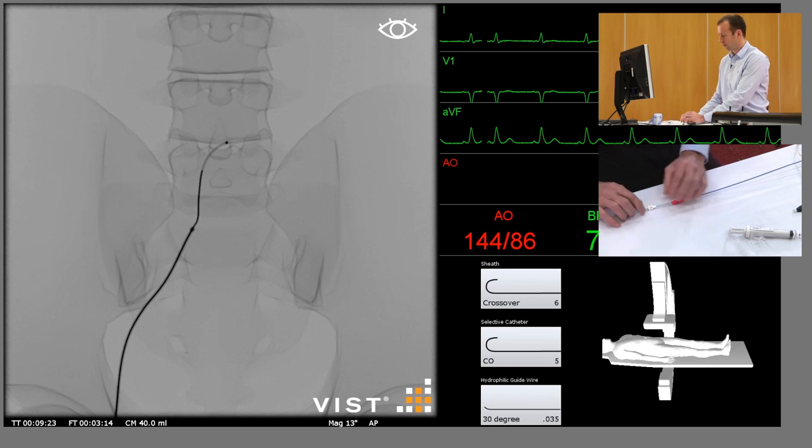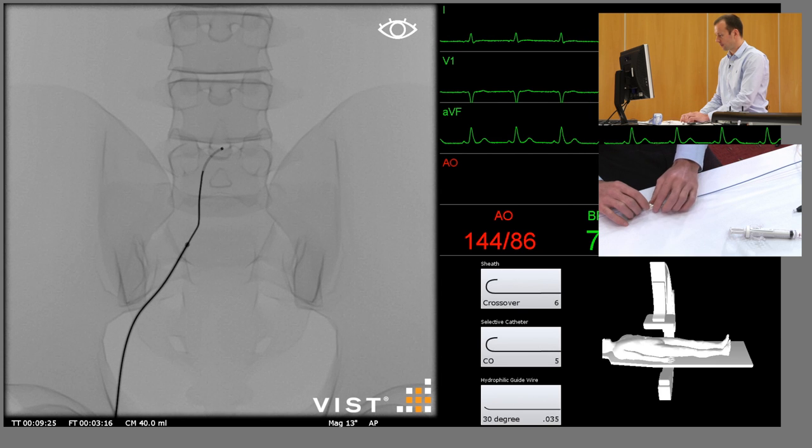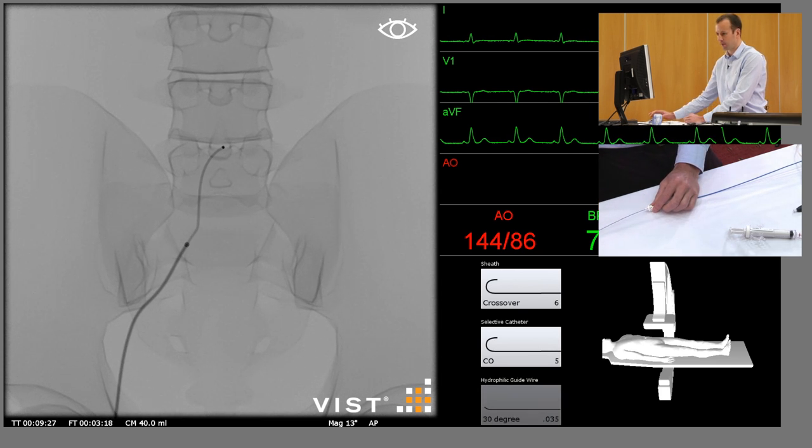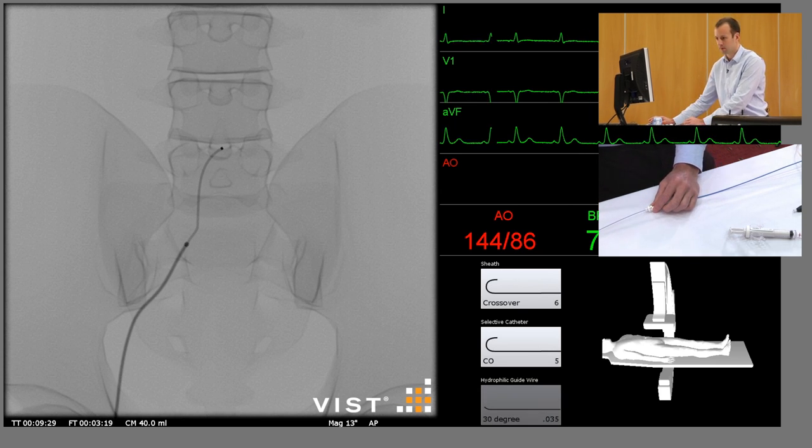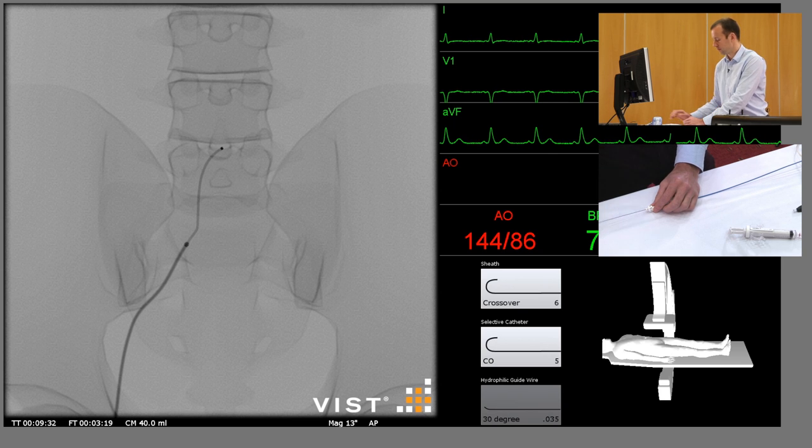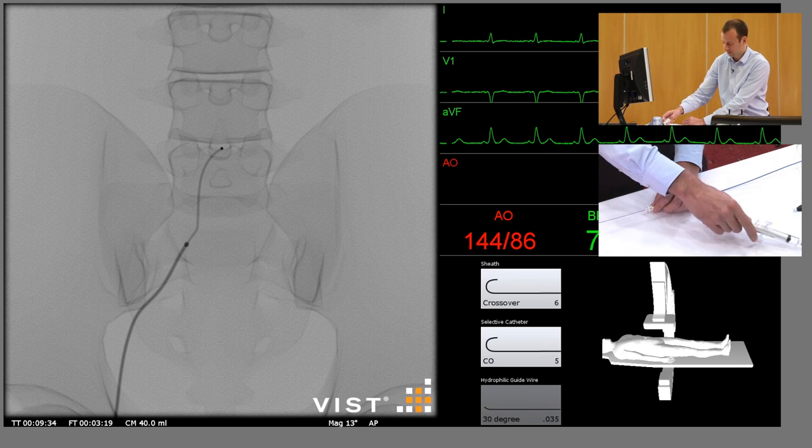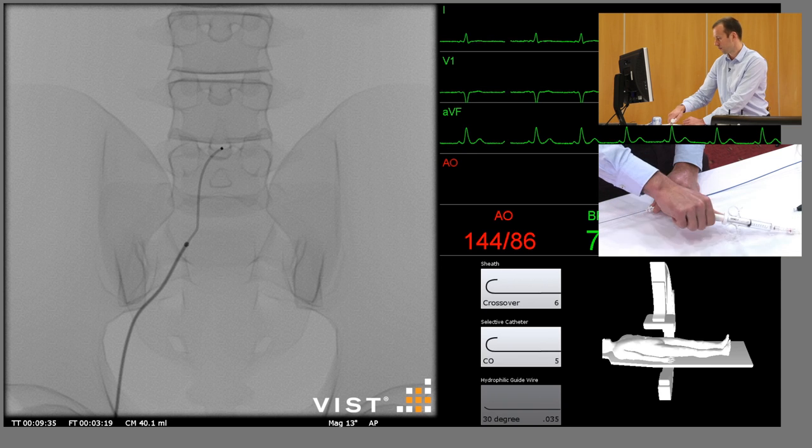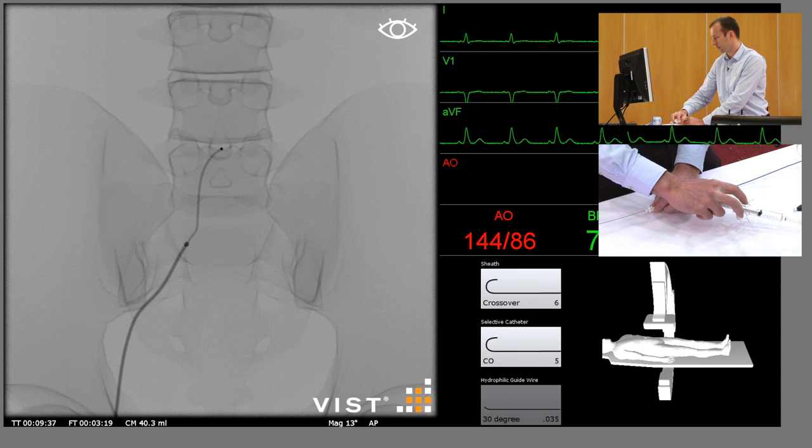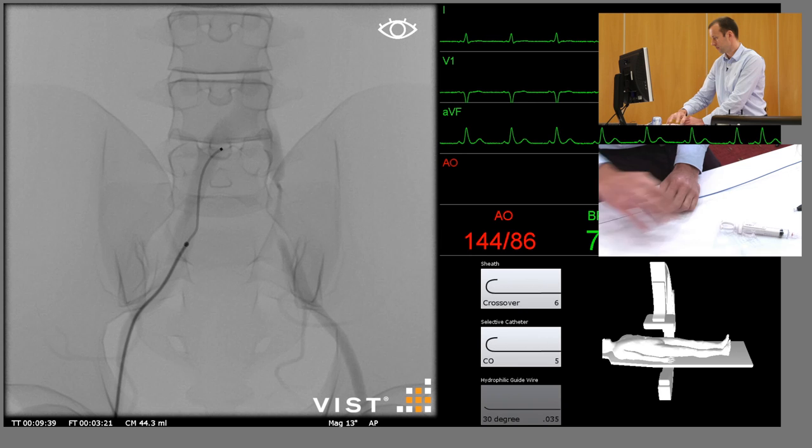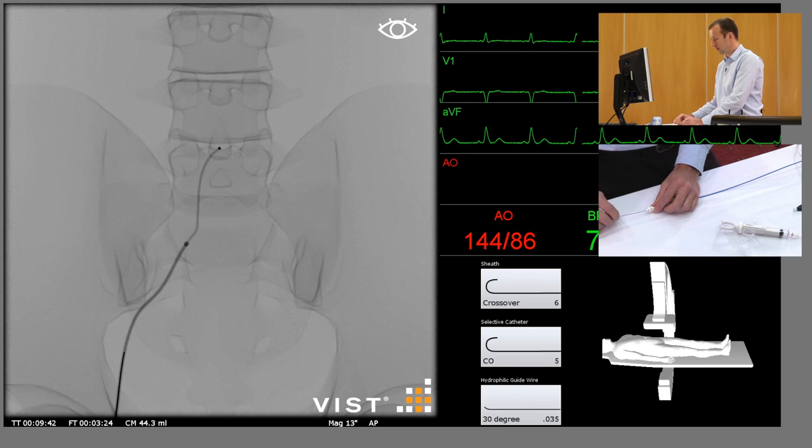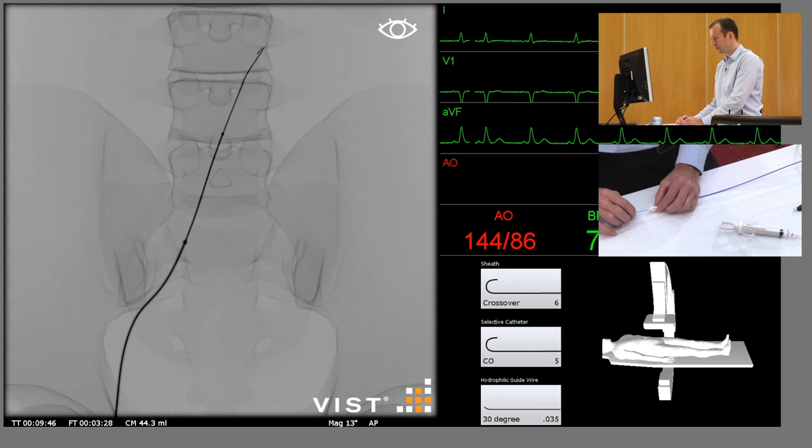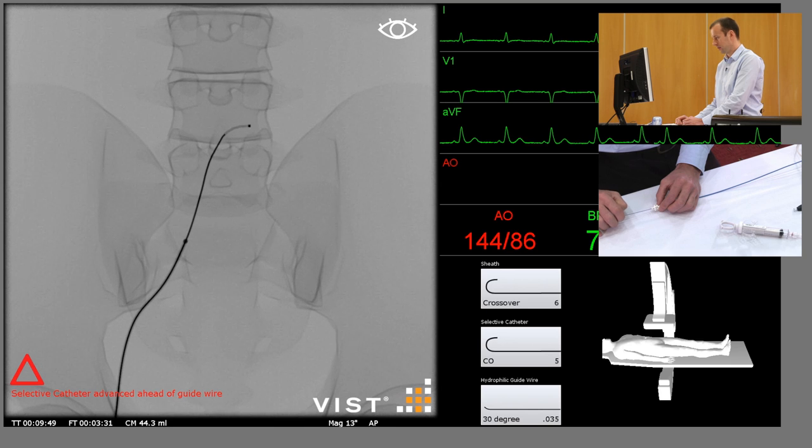At this stage I'm struggling to find the aortic bifurcation so we can just repeat the angiogram. Inject a little bit of contrast. As you can see I'm clearly too low. So we'll advance the catheter over the guide wire, and there we go, the catheter is deflecting as we expected.